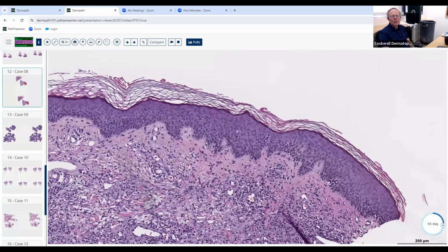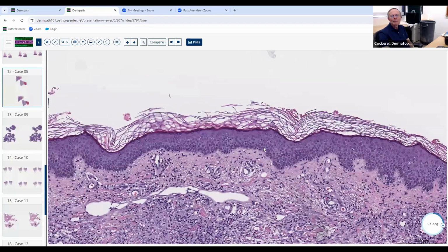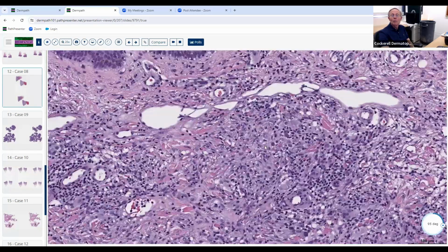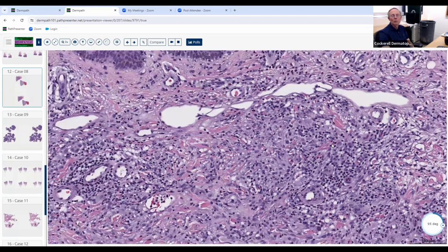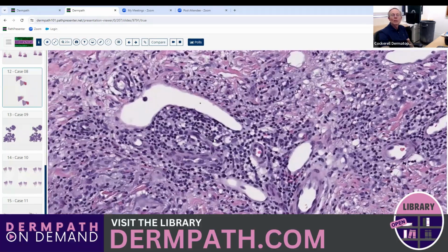And then, so this is probably a little bit too difficult for them to show you this without some clues on the exam, but you can make the diagnosis here because of that, coupled with this granulomatous inflammation down here with these atypical lymphoid cells that are present within the cytoplasm of these histiocytes here. There's also some eosinophils in here, interestingly enough, and you do get eosinophils sometimes in mycosis fungoides. So that doesn't mean that it can't be MF if there are eosinophils.